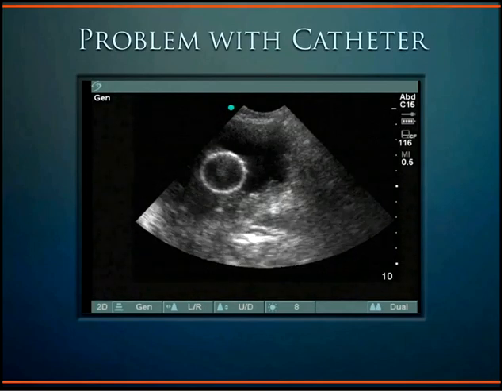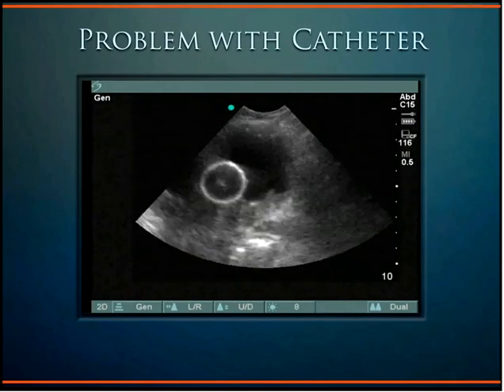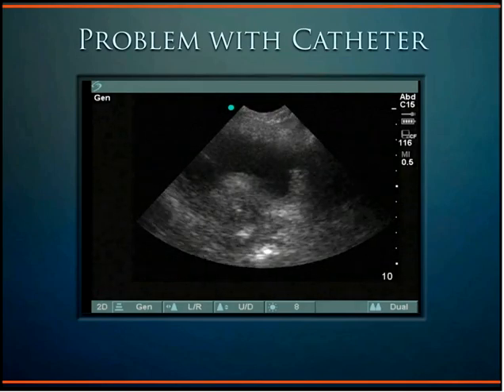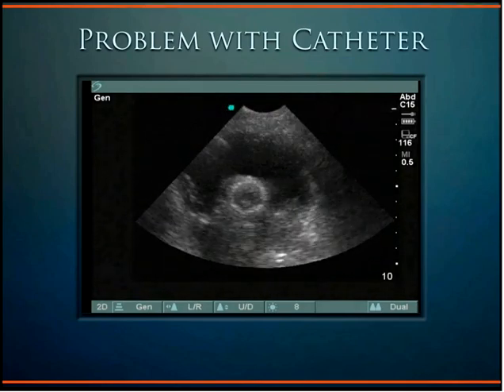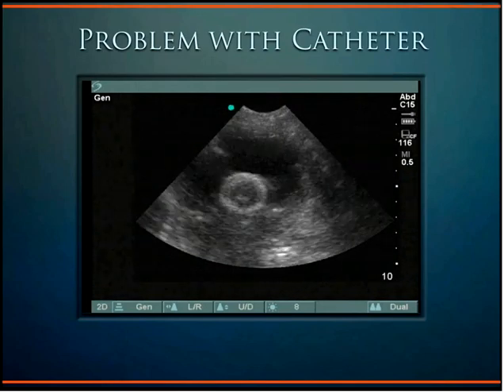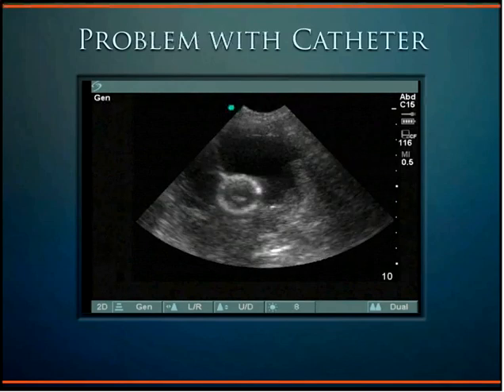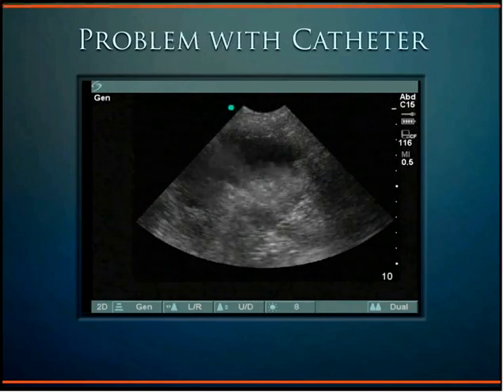The patient, though, continues to complain of urinary retention, and the Foley is still not putting out urine. After multiple attempts to irrigate and finally to deflate the Foley balloon were unsuccessful, a 22-gauge needle is guided percutaneously under ultrasound to rupture the Foley balloon for successful Foley catheter removal.